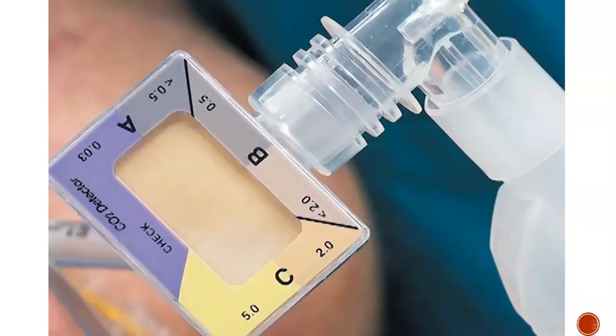Okay. So on the opposite side of that, if we have a PaCO2 of 56 and then our end-tidal CO2 is 32, then that gradient, the difference, is what we look at, okay? That difference is 24. And that is what's going to tell us that there's usually significant areas of the lung that are ventilated but not perfused, so there's dead space.